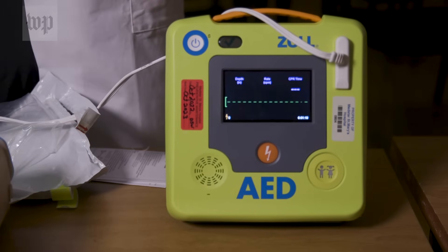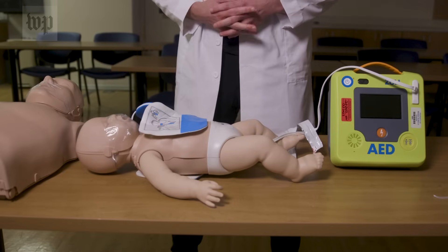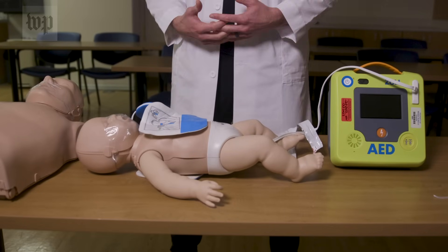The device will determine the initial rhythm. If it believes that a shock is needed, it will tell you to give a shock. If the initial underlying rhythm does not need a shock, then the device will tell you to start CPR.